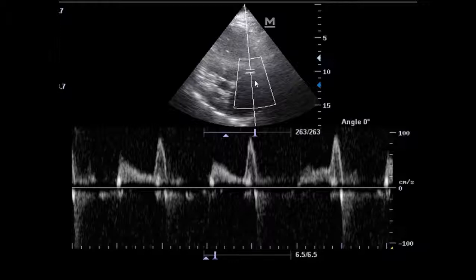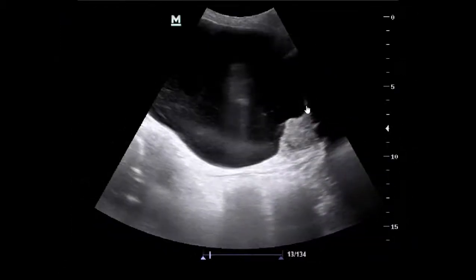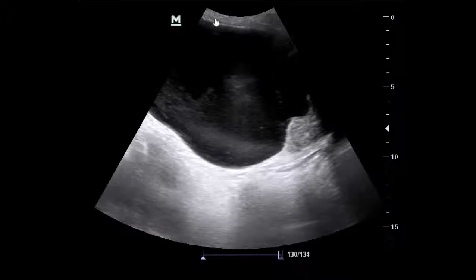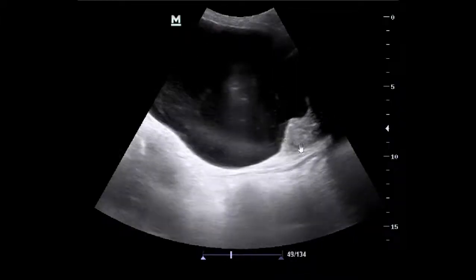Okay. What else? Traditional teaching for acute renal failure is pre-renal causes, renal causes, and post-renal causes. So, when you talk about the value of ultrasound in acute renal failure, you should assess for obstructive causes. Let us see for our patient. Oh, it's very clear here that our patient has a distended urinary bladder in sagittal view, and this is the prostate.